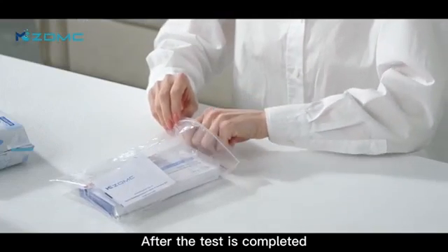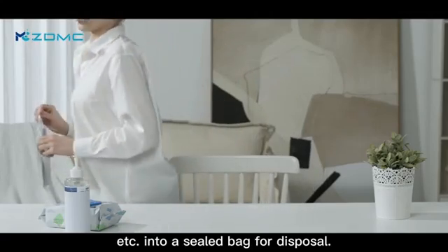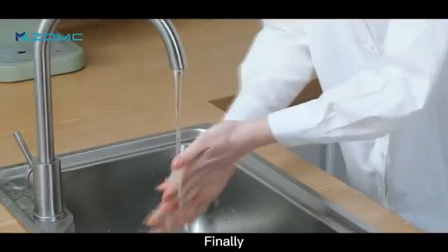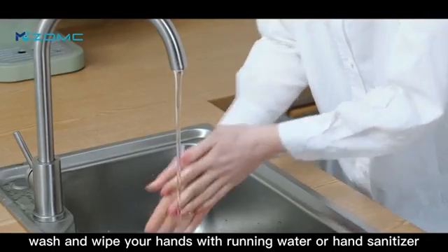If the result is invalid, a new test cassette should be used for retesting. After the test is completed, put the used test cassette, packing bag, etc. into a sealed bag for disposal. Finally, wash and wipe your hands with running water or hand sanitizer.